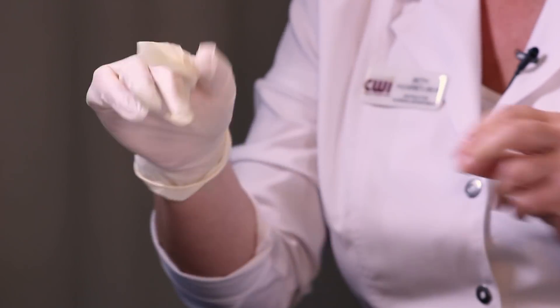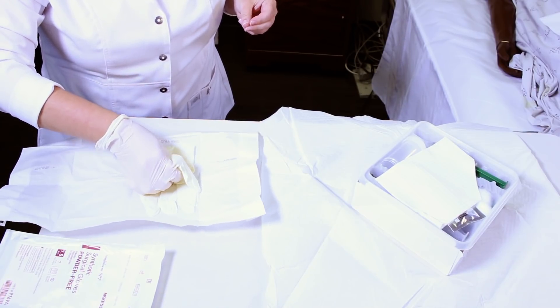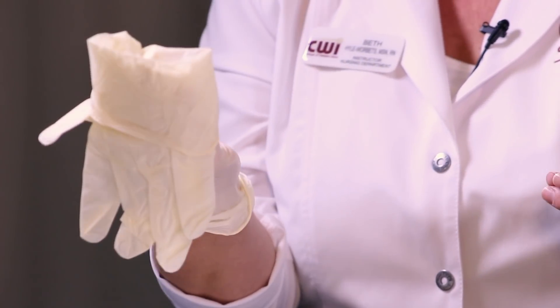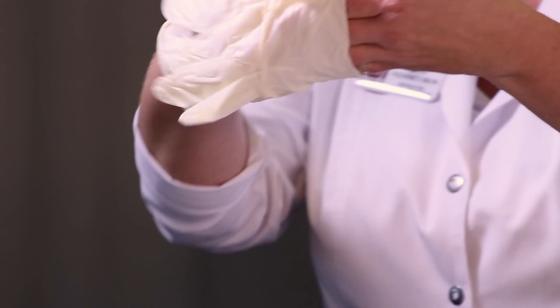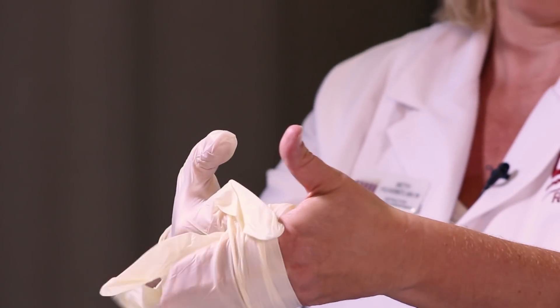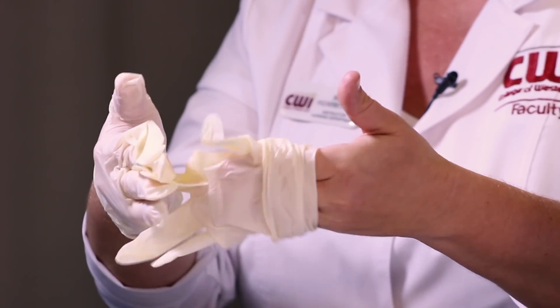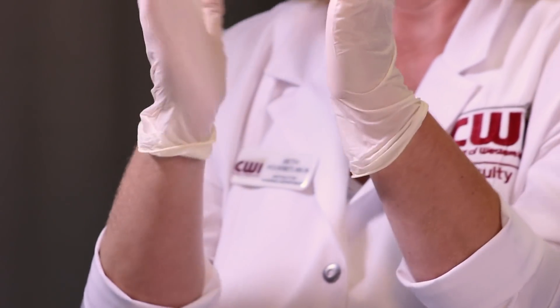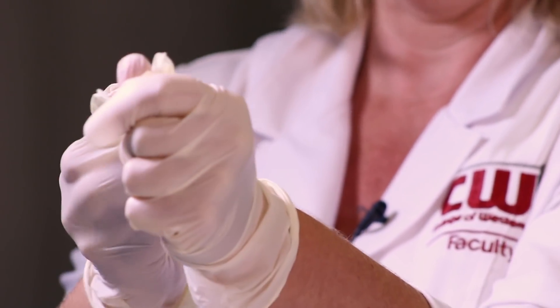Don't worry when you're sterile gloving if you get two fingers in one of the glove holes — that can be fixed after you're completely sterile. Then put your four fingers under the cuff of the other glove, again with hitchhiker thumb. Now I'm sterile gloved, so I can fix the fact that I have two fingers in one.